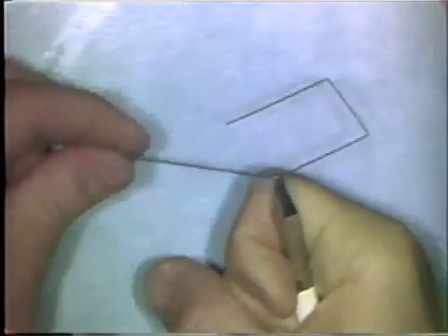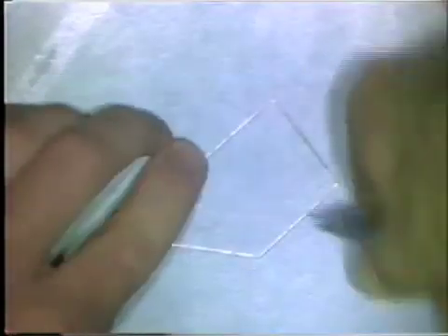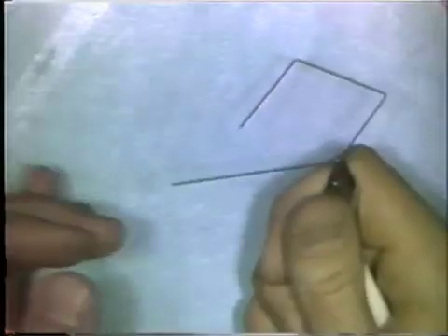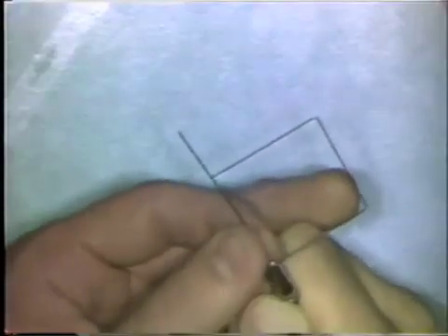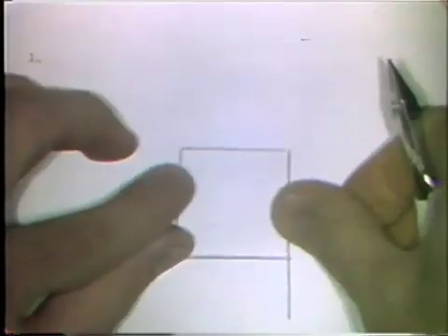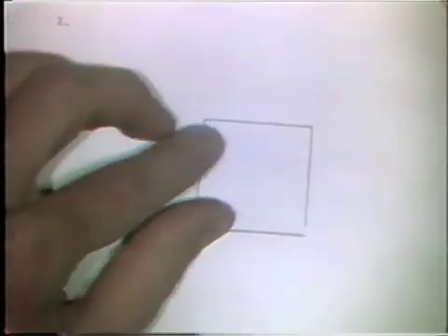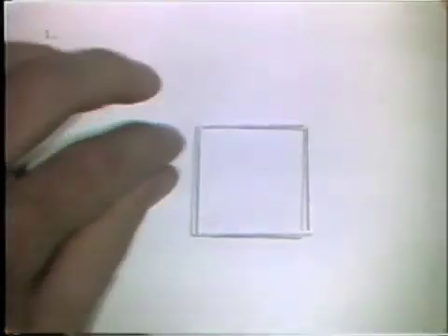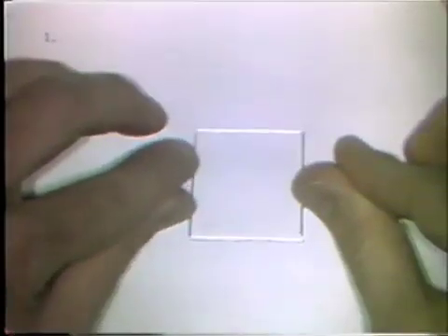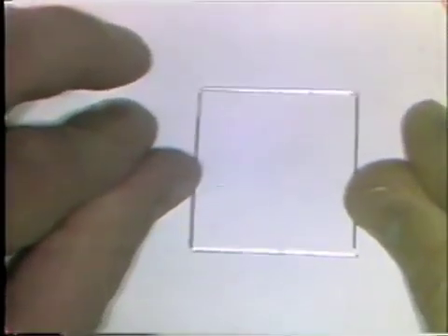First, about 30 degrees, check the flatness. And then complete the final leg. You try it back on the pattern, and you can mark the wire at the point where you want to cut it off. And the first exercise has been formed. When it's properly formed, the wires should completely cover the lines on the exercise sheet, and it should be flat on a glass slab or formica surface, completely in one plane of space.